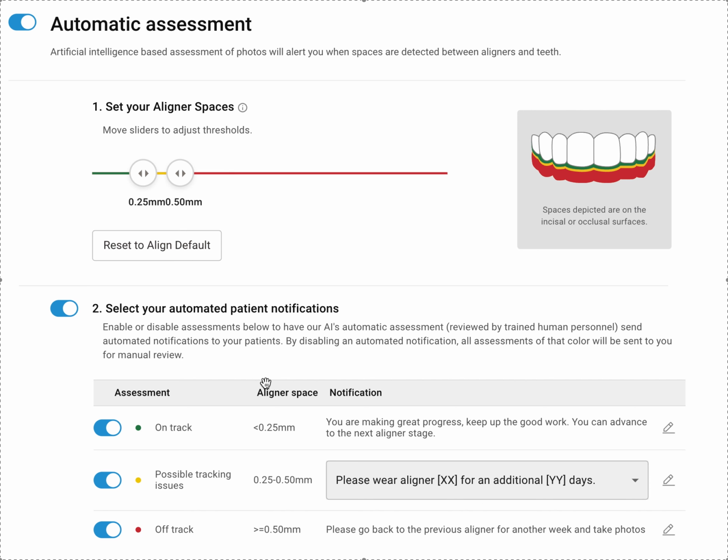And just to give you more fuel for the fire, the vast majority of orthodontists are giving the whole darn box to the patient and putting them on some type of virtual care, be it Invisalign Virtual Care with AI, In-Hand Dental, or Dental Monitoring. All right, thanks so much.